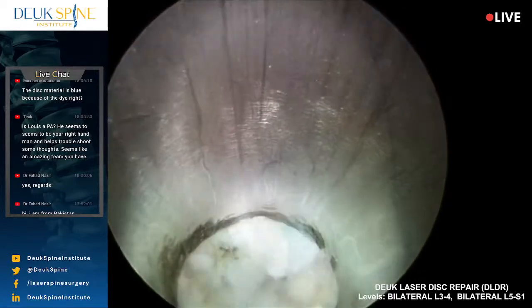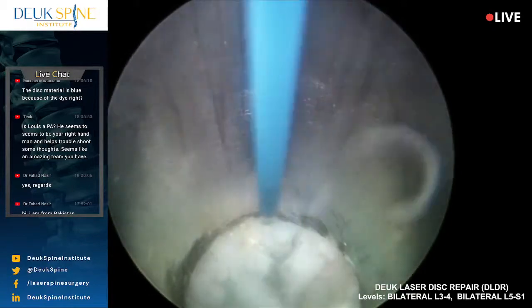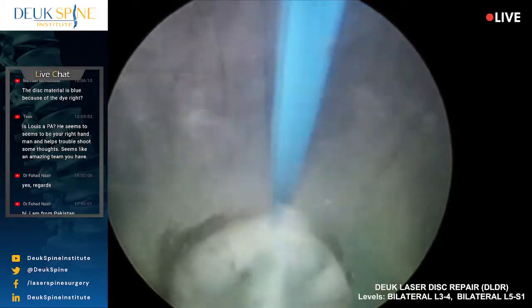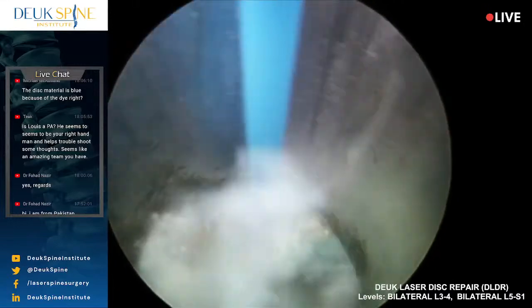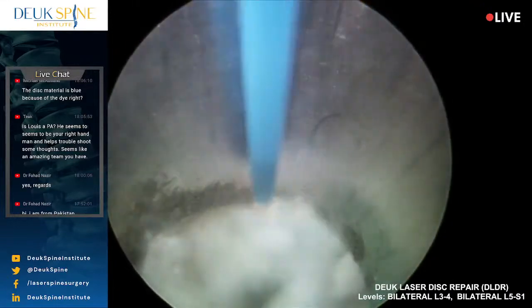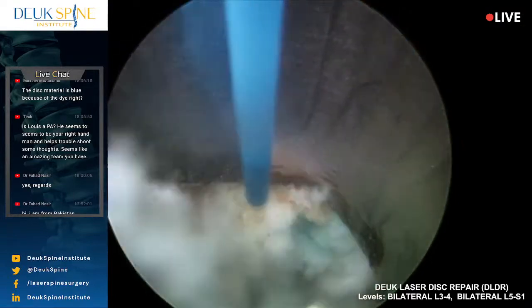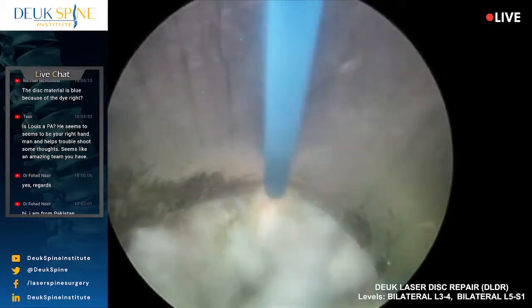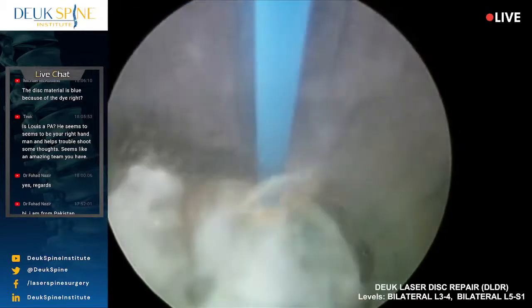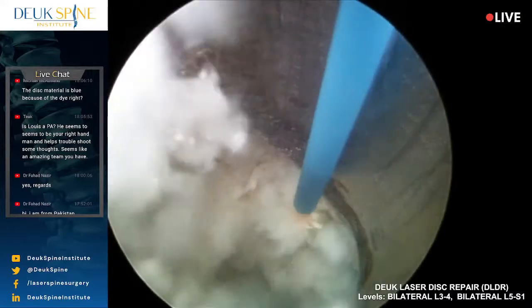How many joules have we used? 40. That is a lot. It's not a record, is it? But it's close. 64 on one disc? 2019.